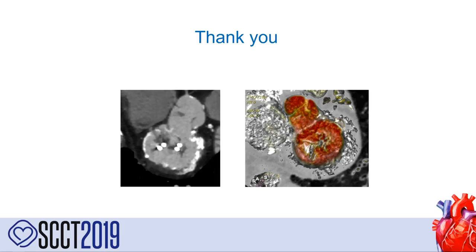So if you had a very small mitral valve, and you're placing a valve in valve, it's going to be smaller than that. And that's one where you would entertain the potential of fracturing the valve. You would put in the virtual valve and see what you're left over with. I mean, that's one option. We don't fracture the mitral valve very often. I can think of two or three.